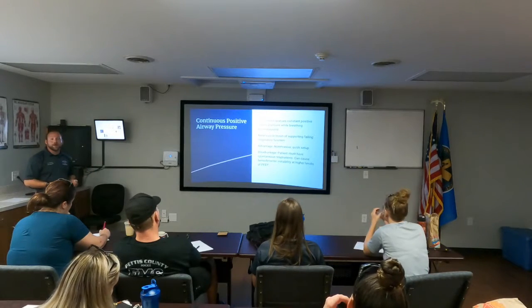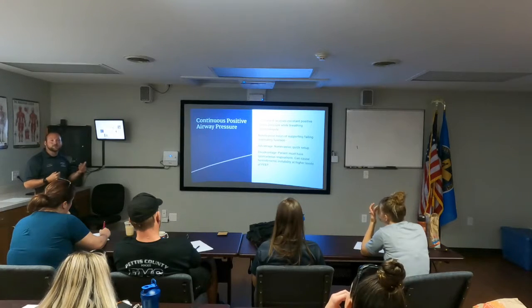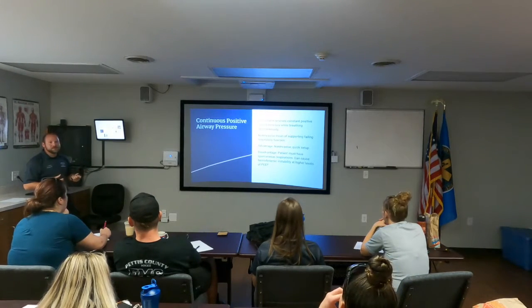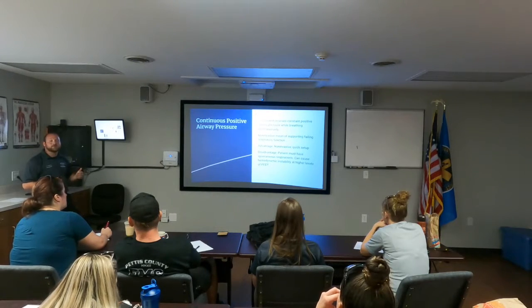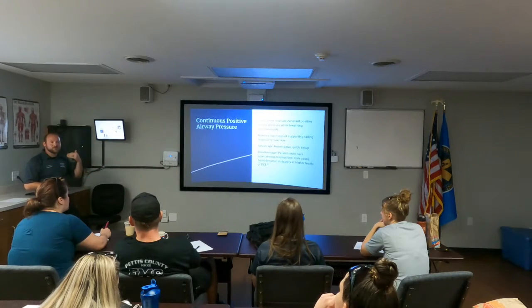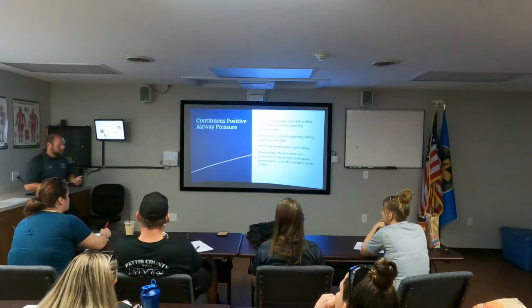Disadvantages: they've got to be awake, they've got to be coherent, they've got to be able to follow commands to be able to use CPAP. The problem is that if you have an apneic or unresponsive patient you're putting CPAP on, it is a constant pressure being pushed through. They have no chance to work against it or offload it. You're just overinflating the lungs.